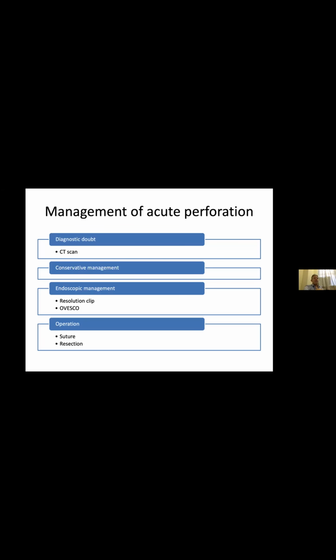surgically. Endoscopic management: if you see at the time that you've perfed or you're worried about perforating, you can use a resolution clip to try and close it, or an Ovesco clip. There's a very nice grasper that Ovesco has. So you can grab one end with that, grab the other end with that, pull it in and place the Ovesco over it. Clearly the disadvantage with the Ovesco is you've got to come out and go back in again. But certainly you can manage full thickness, intraperitoneal perforations conservatively. Remember, you've got a prepped bowel in the right patient. It can work and is well described.